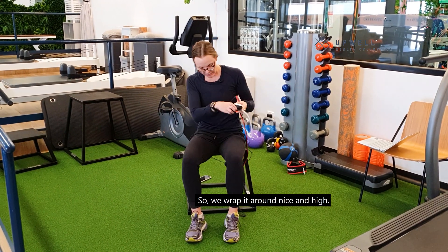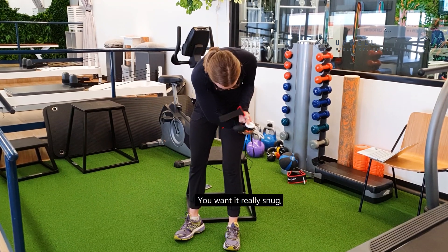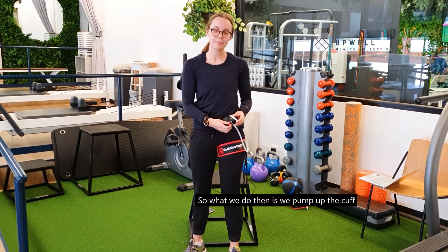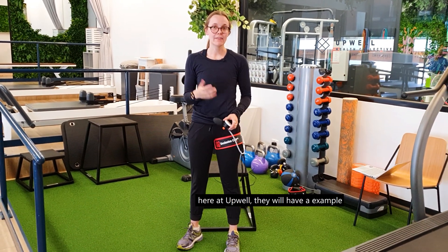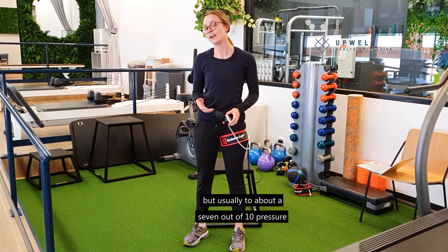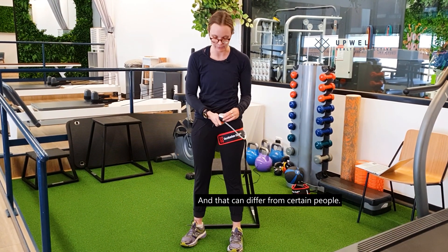We wrap it around nice and high — you want it really snug. Then your practitioner, physio, or exercise physiologist will determine how much to pump it up for you. Usually about a 7 out of 10 pressure is recommended, though that can differ from person to person.